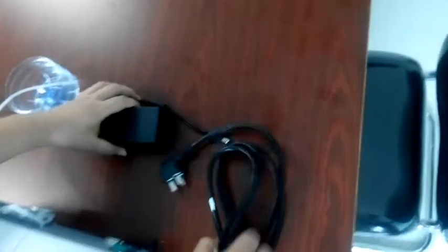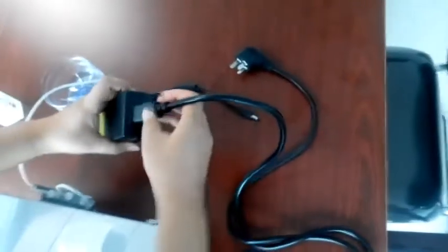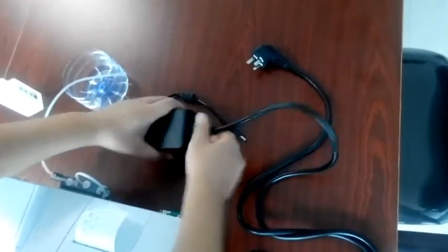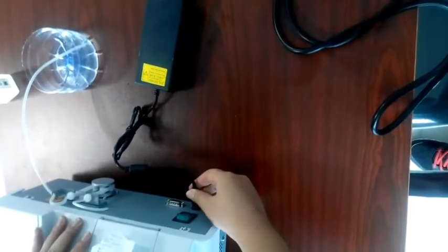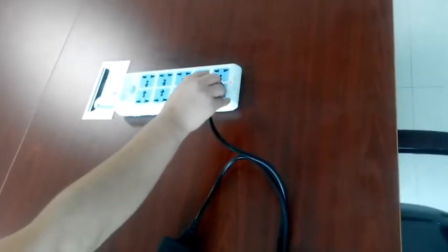Then we should connect the power. This is the plug switch, which you need to match to your market standard. We should connect it with the power adapter — one side connects to the machine and the other side connects to the power.